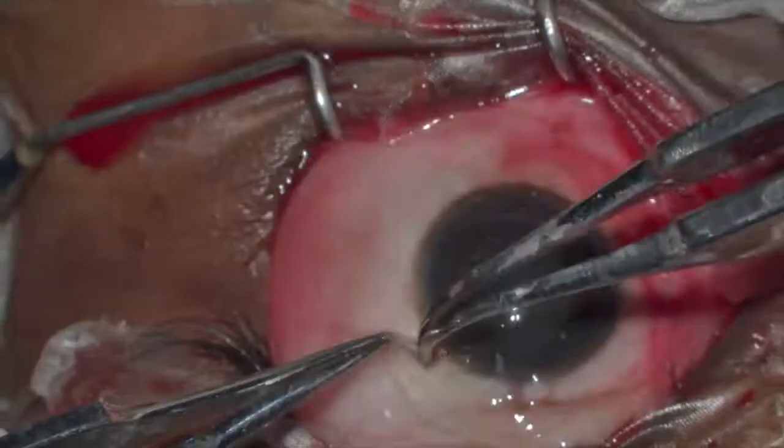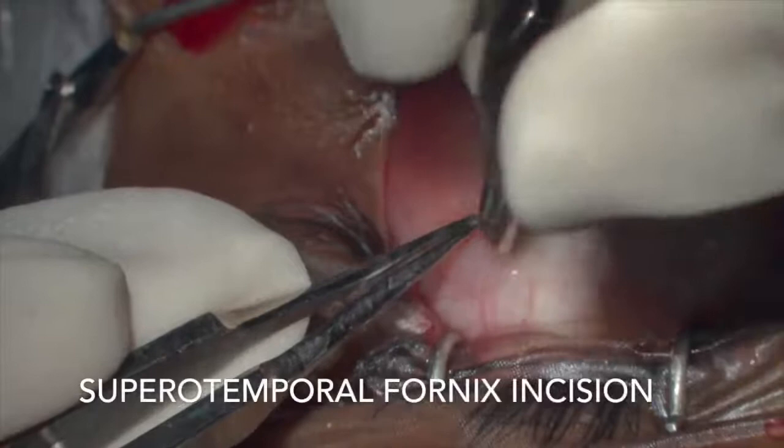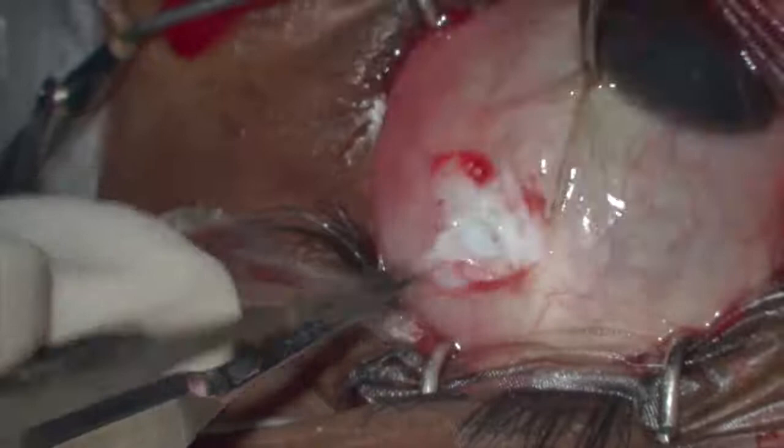After medial rectus recession, a superotemporal fornix incision is made in the left eye. This allows better exposure of the posterior aspect of the muscle as compared to the limbal incision.